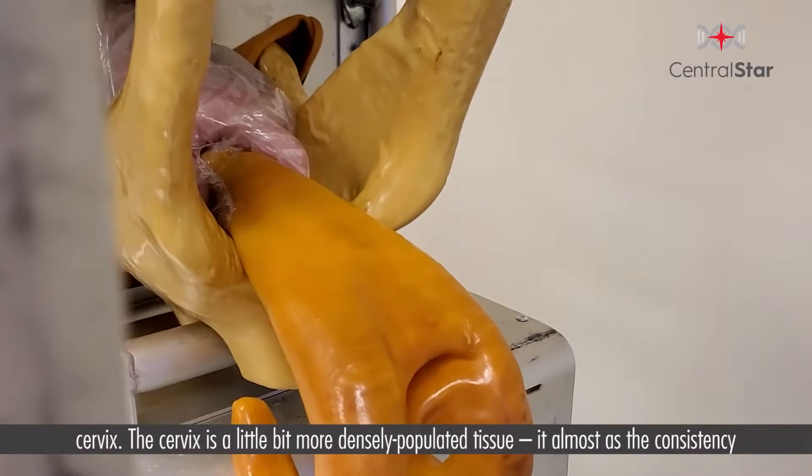Identify that cervix — it's a little bit more densely populated tissue, almost has the consistency of a hot dog. It will bend, it will maneuver, it's a little bit spongy. Ultimately, like we just talked about, we're trying to minimize that surface area to the fornix — that dead spot — and we're going to try to start getting the rod entered in the cervix. Once we've begun into the cervical opening, everything is really done by placing the cervix over top of the gun, not trying to force the AI rod through the cervix. We're bending, we're manipulating, and we're not forcing — we're just letting the gun proceed naturally forward.